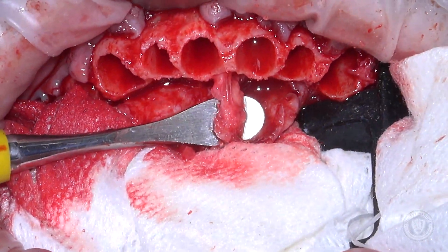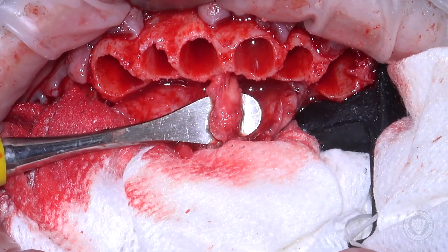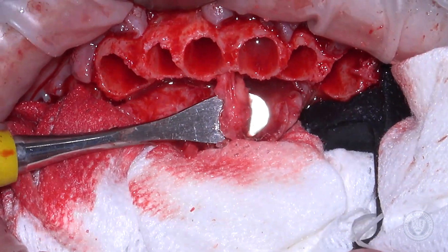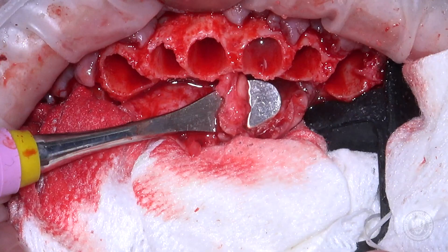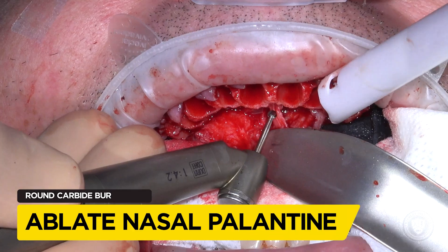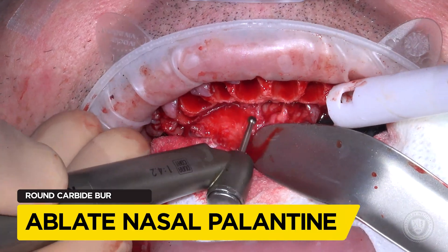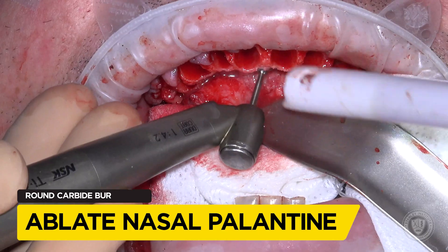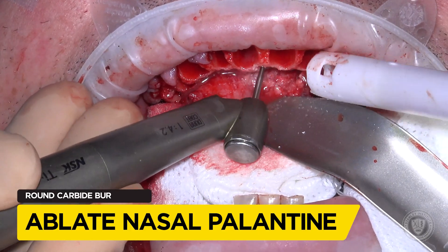It also doesn't bleed very much — it doesn't create a big bleeder as long as you don't go too apical into the canal. So it is really kind of a no-brainer anymore. We don't even think about it. We've got to get that tissue out of the way in order to get the bone foundation guide in place for the surgery. It just isn't a complication that we worry about anymore.